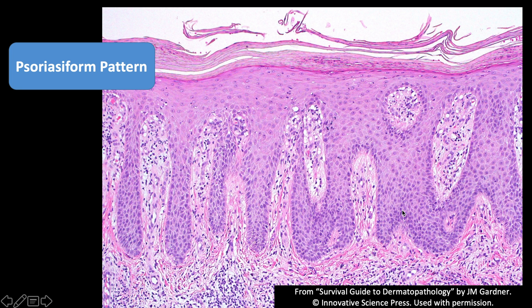Those are all features very characteristic of psoriasis. Psoriasis in particular has not just acanthosis, but very regular acanthosis — all of the rete ridges are about the same length and about the same size, and they all look just the same. That's very typical of psoriasis in a classic situation.